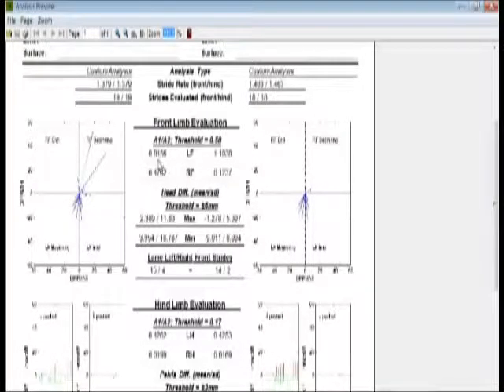However, looking at the analysis after the outliers are removed, the one on the right clears things up a bit. The A1-A2 value for the left front is now above 1, stronger evidence of a left forelimb lameness, and, most importantly, the min-diff head is now minus 9 millimeters, with a standard deviation of only about 8.7 millimeters. This is much more consistent and clearer evidence of a mild left forelimb lameness. This can also be seen by comparing the corresponding forelimb ray diagrams.